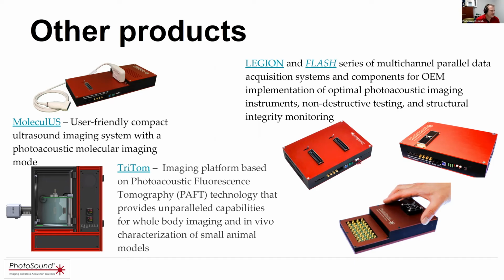Then the last question that I see, and that's a question that I have too. So you said the pulse of your linear accelerator is 4 microseconds. Usually the spectrum of the signal is a combination of the pulse duration with the size of your object. So we see a 1 centimeter object has a lot lower frequency than a 0.1 centimeter object.